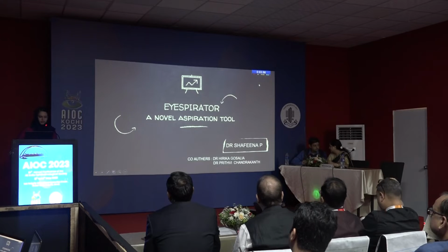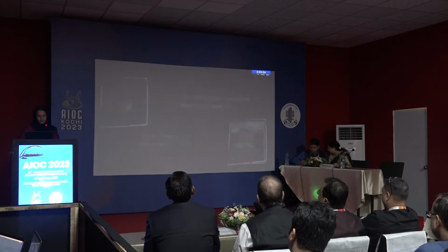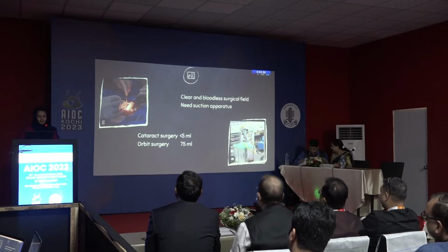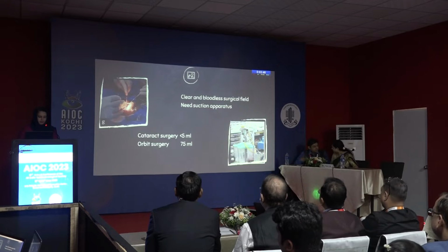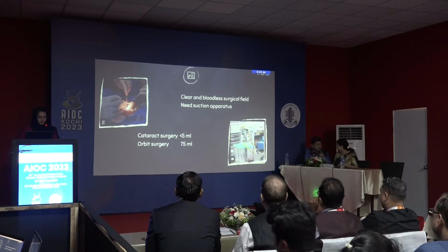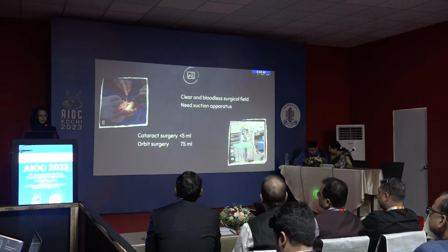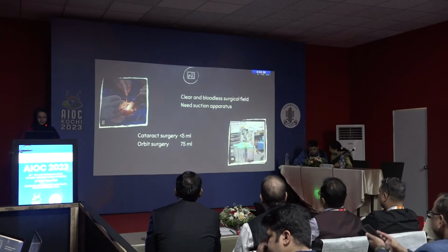Good morning all. I'll be talking about Eyespirator, a novel aspiration tool. In surgical practice, it is essential to have a clear and bloodless surgical field. So the need of a suction apparatus is an essential part of surgery. Ophthalmology as a surgical field will have a minimum amount of blood loss, like in cataract surgery, less than 5 ml, in orbital surgery, around 75 ml.